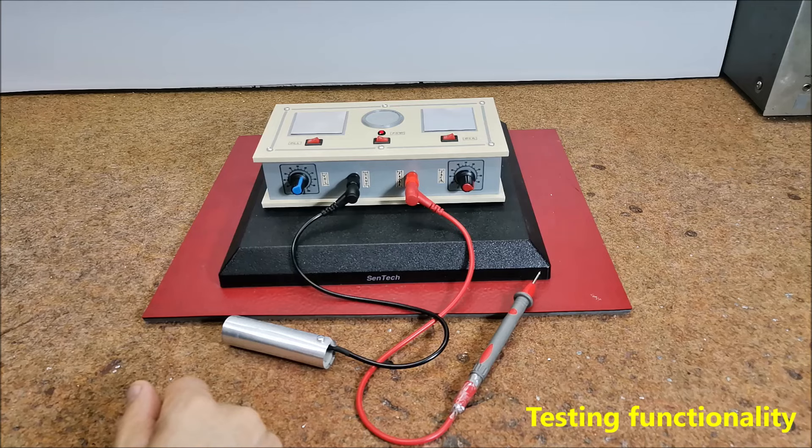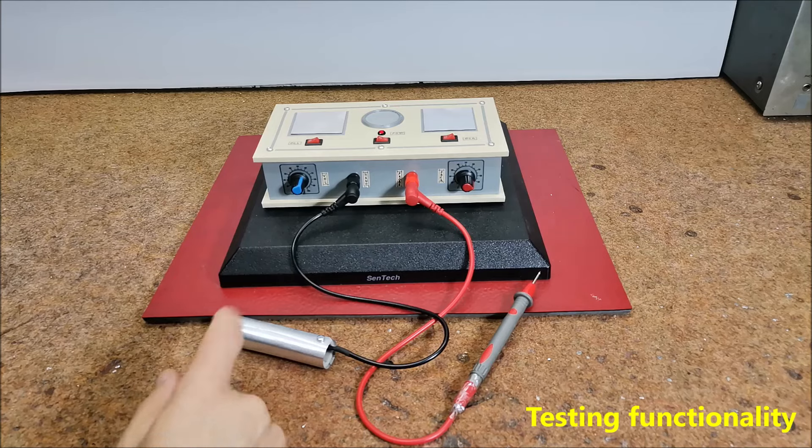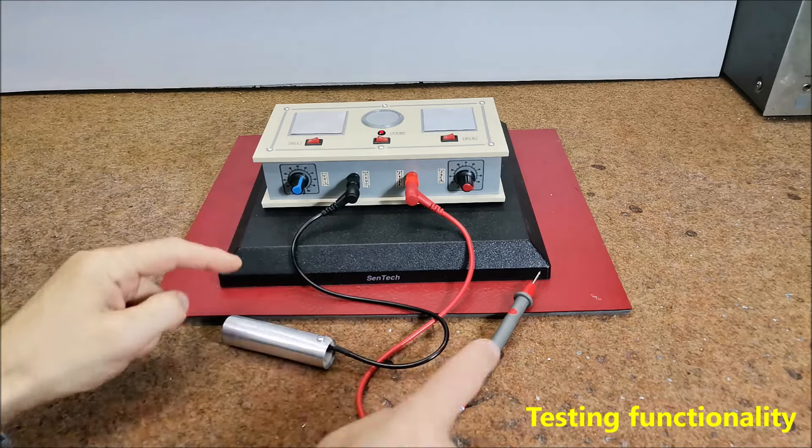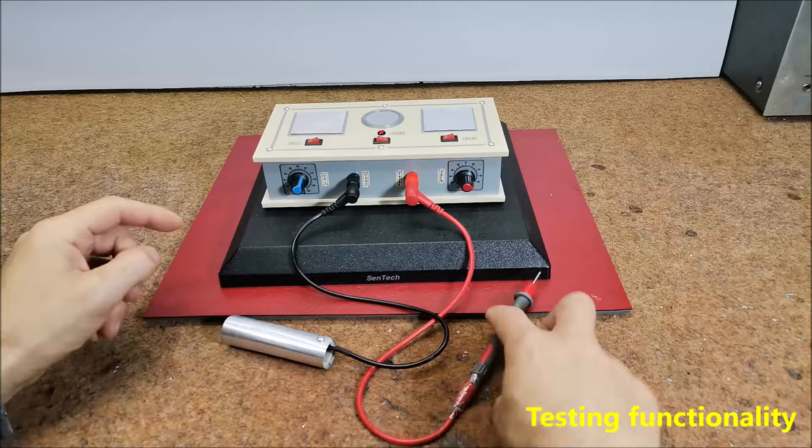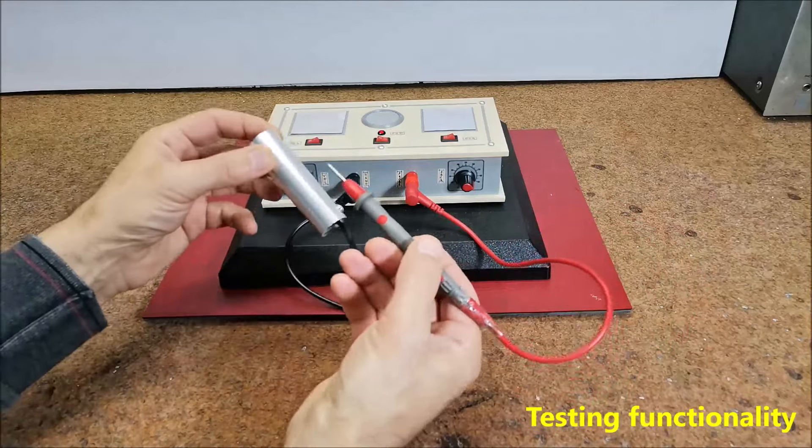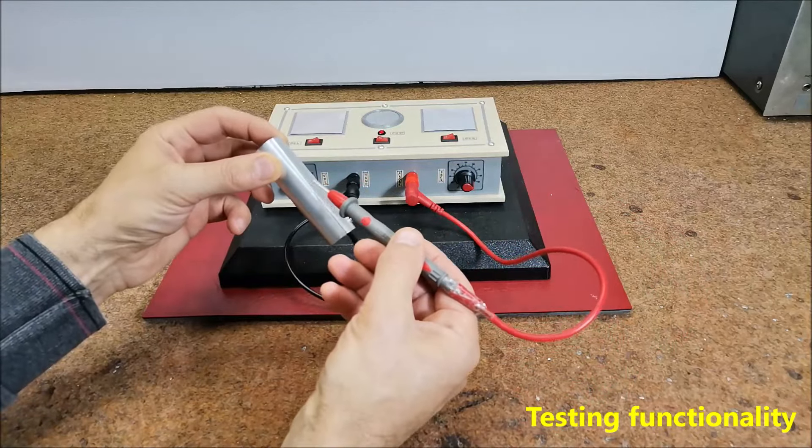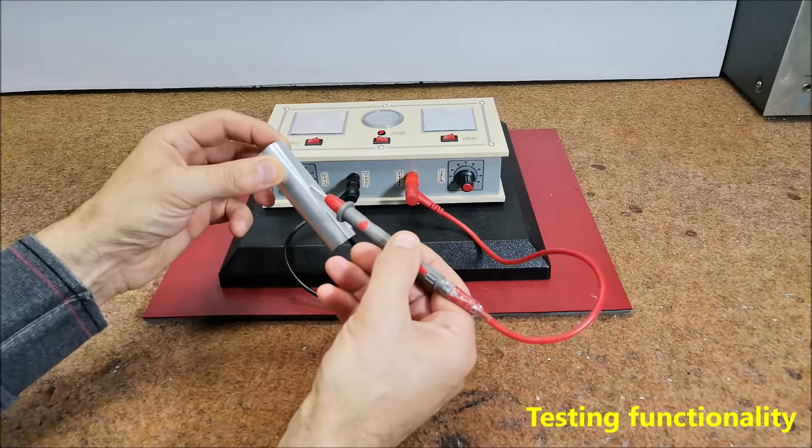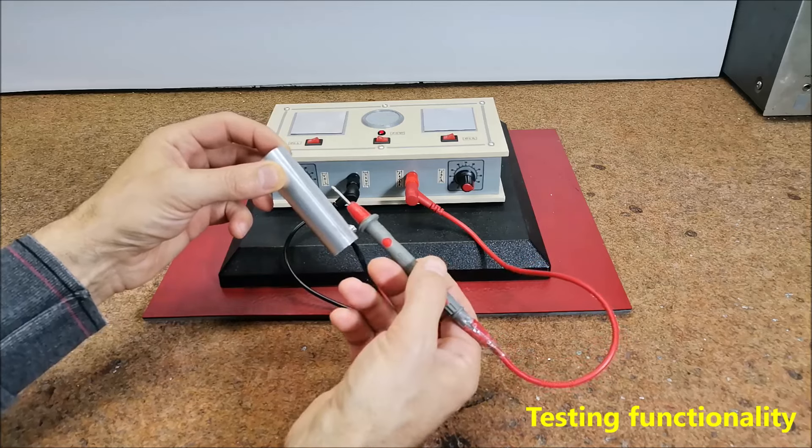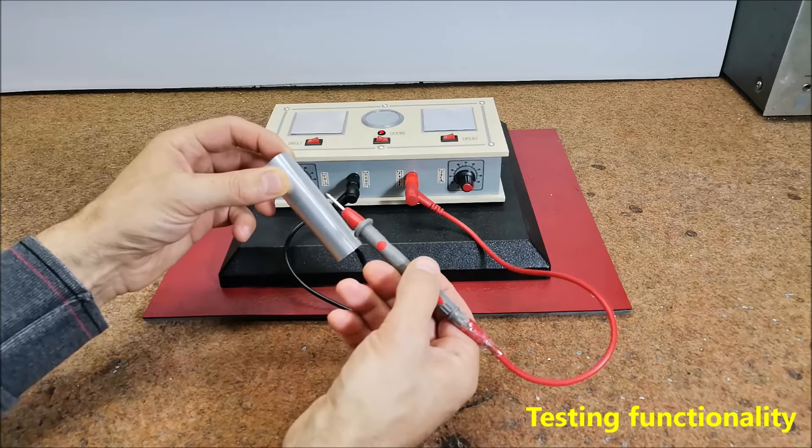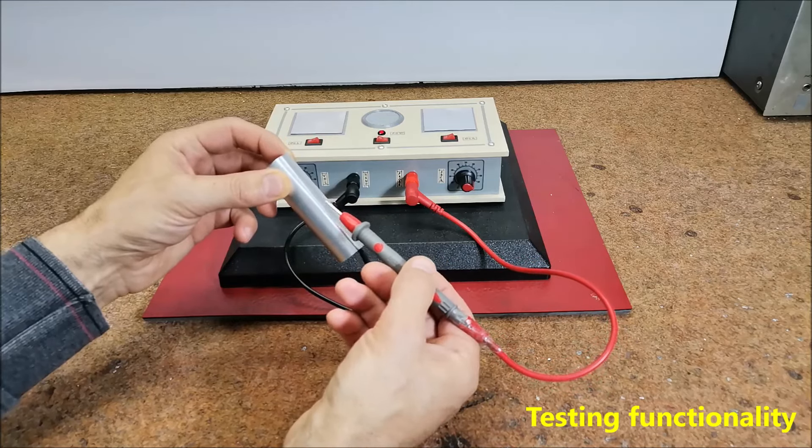We can test the circuit by briefly touching the probe and the handhold. The speaker should produce the sound like popping corn.